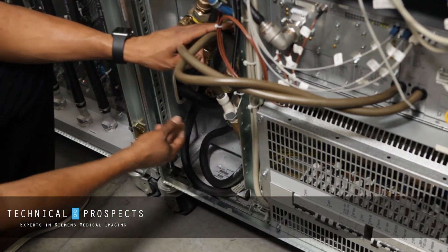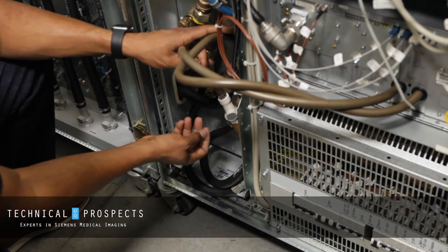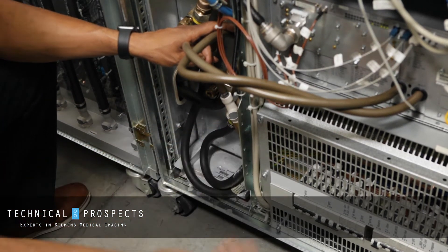We have two connections here, incoming and return. So we'll check for any cracks or any signs of a leak visually.